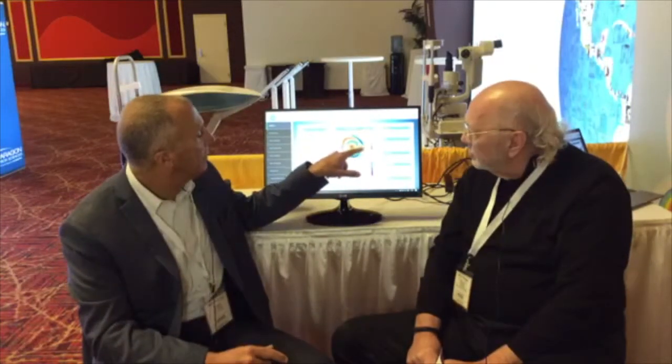So we get the fit, everything else we want. We know we're going to have different meridians and toricity, and now we have this large pinguecula, and we all know we're going to get compression. And labs now can design a vault or a channel to not compress that area. And what the Eaglet will do, I can take my cursor, I can measure the height, the elevation, the depth, the width, everything I need to give to the lab, and say, put this exactly there, and it's a big game changer.